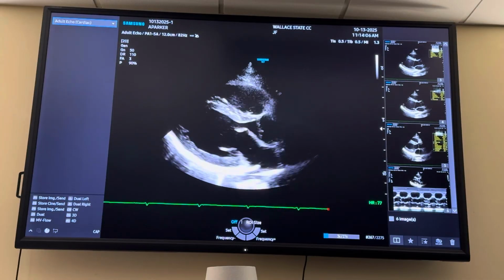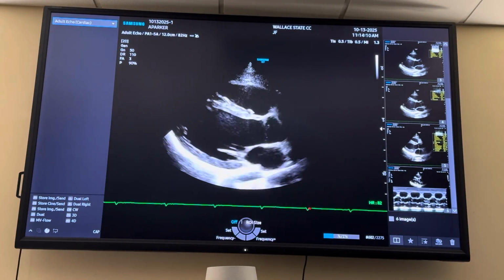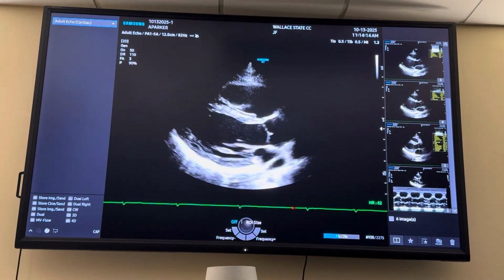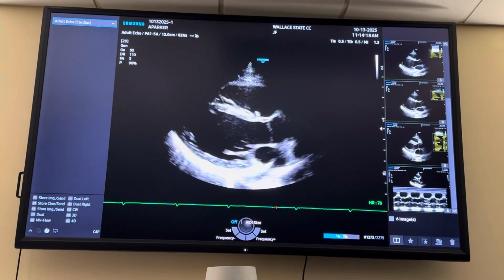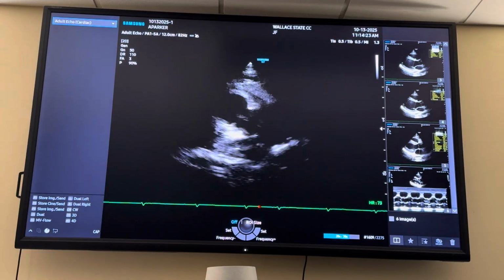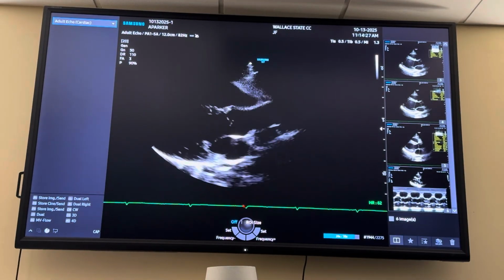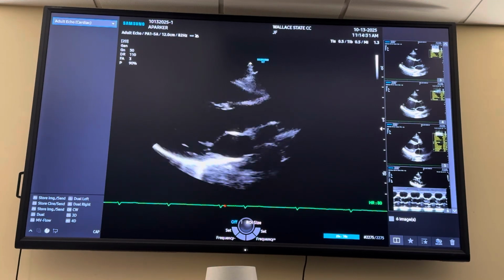So now we're gonna do your RVIT, your right ventricular inflow. So here from parasternal, you know what we're missing on here? And we'll have to look to see if it's on the grade sheet. Does anybody know what we're missing? We're missing the ascending aorta. Now, it may not be a part of the protocol, but just know how to get to it, know how to measure it. We've gone over this, we've looked at it.